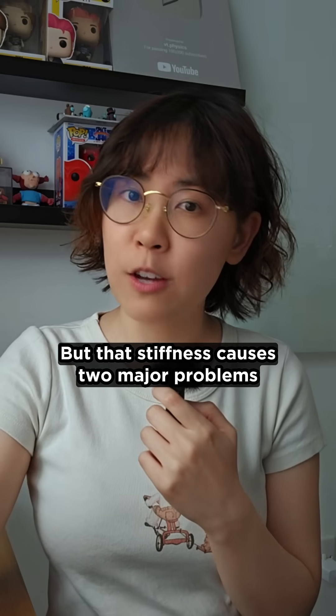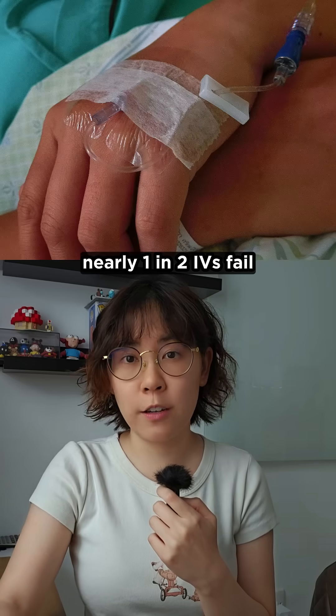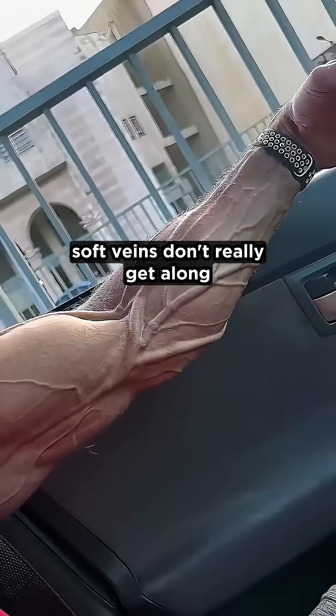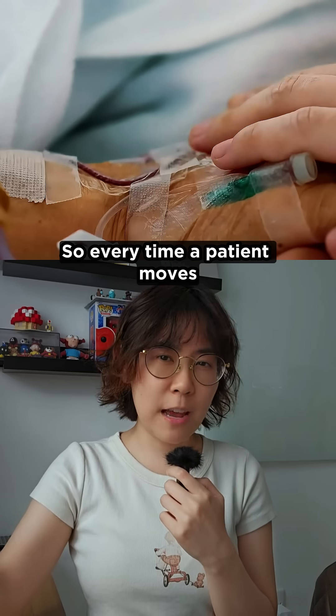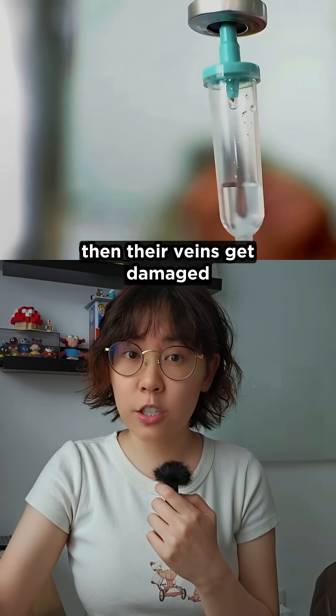But that stiffness causes two major problems. First, nearly one in two IVs fail, not because of bad technique, but because hard needles and soft veins don't really get along. So every time a patient moves, the needle shifts, then their veins get damaged.